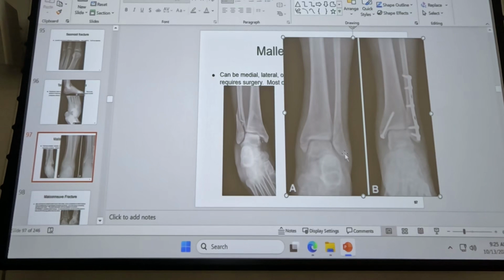I guess it's really on top of, but anyway, you got superimposition there, so it's closer to a 45-degree oblique than a mortise, but you're somewhere in between. But you got a definite fracture line up in here. You got that definite fracture right there. The syndesmosis is not disrupted. If it was, then that screw hole right there would have a screw going all the way across to the cortex of the tibia.